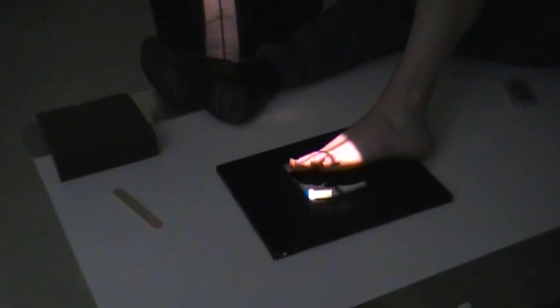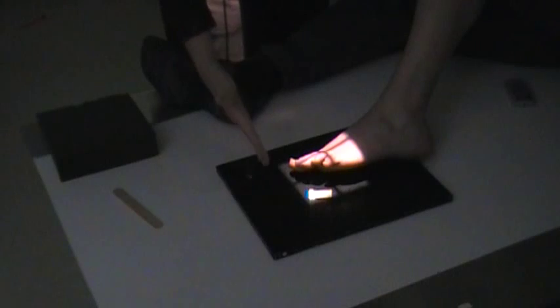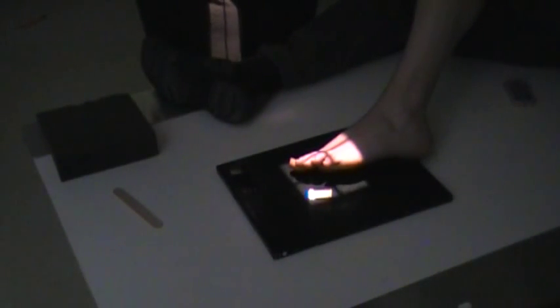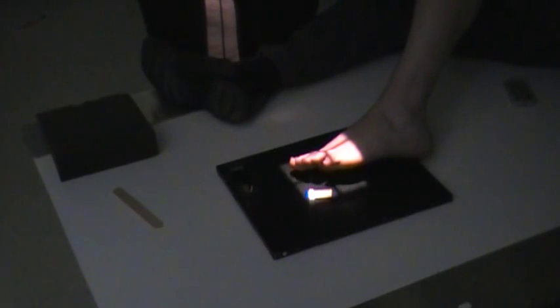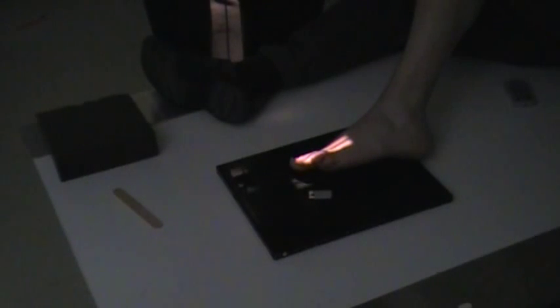For your oblique, again, you can include all the toes. Make sure that you have the tips on them because it's very easy to collimate too much on this. Now if your physician likes for you to collimate further just over the actual digit, you can collimate down at that point.